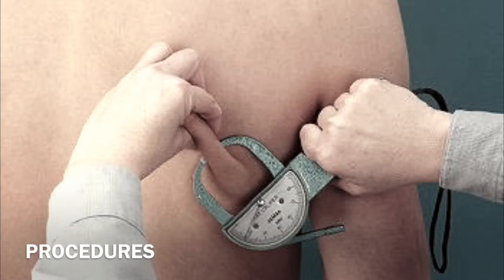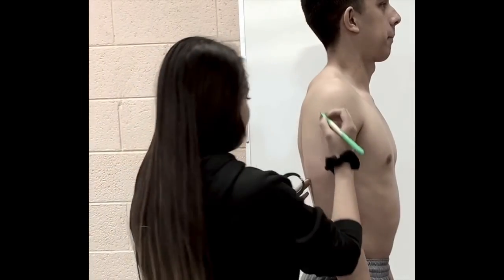The caliper should be placed directly on the skin surface 1 centimeter away from the thumb and finger, perpendicular to the skin fold, and halfway between the crest and the base of the fold. The evaluator should wait 1 to 2 seconds before reading the caliper. Record how many millimeters you have measured and rotate around each site to get multiple measurements. Now that we've discussed the procedures, we will talk about each specific site.